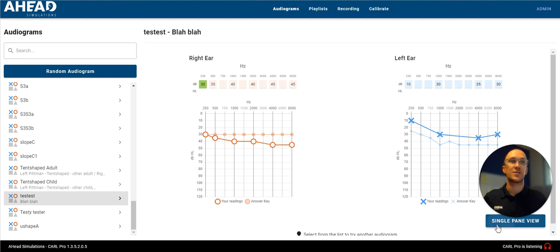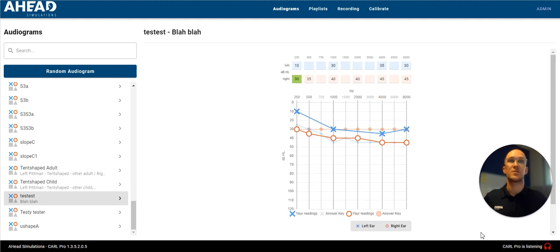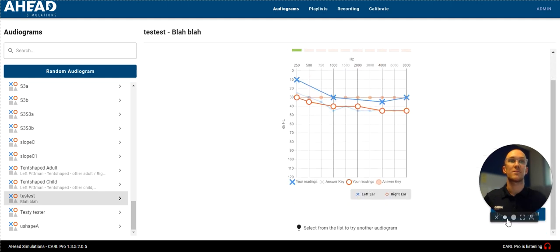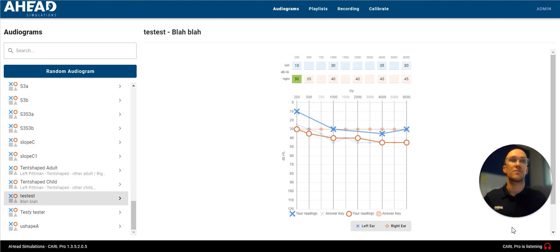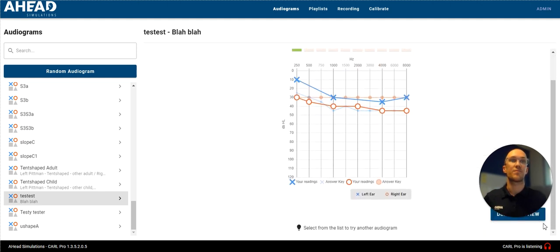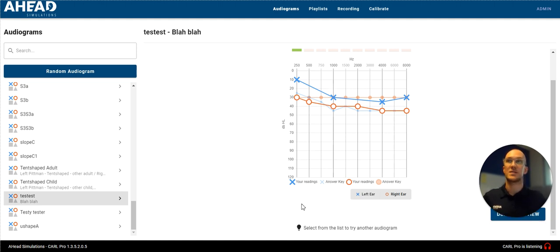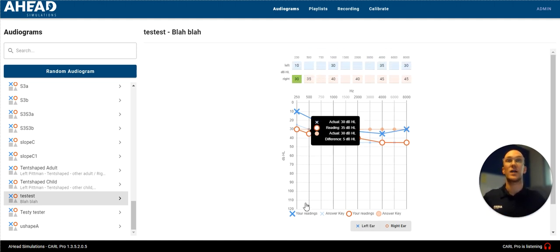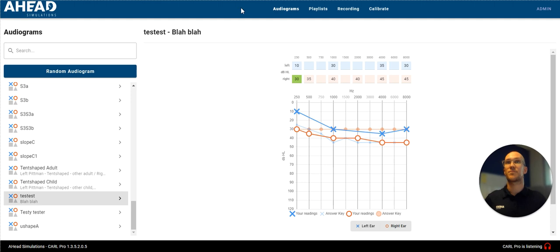You can switch over to a single pane view as well, if you'd rather, or if you'd prefer. And now it's giving you a prompt at the bottom, which is select from the list to try another audiogram. So that was a first little intro.